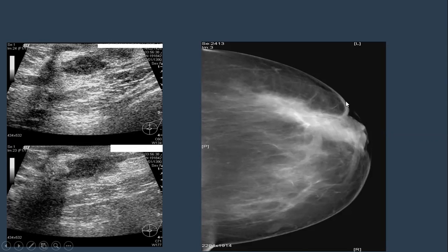So what is tracking toward the nipple, long standing and with pus discharge? Could it be a fistula? Yes, fistula. Or a tract going toward, yeah, a cutaneous fistula.